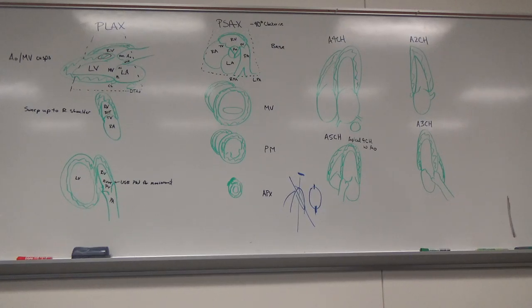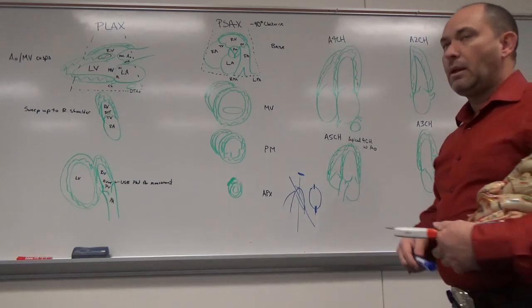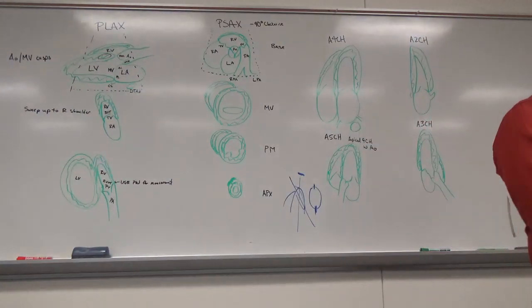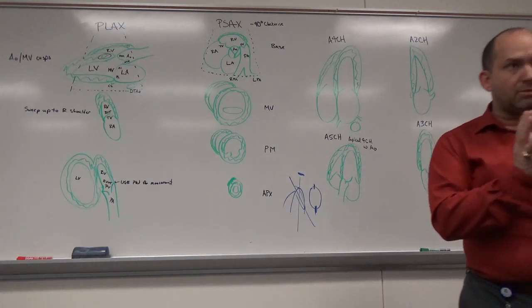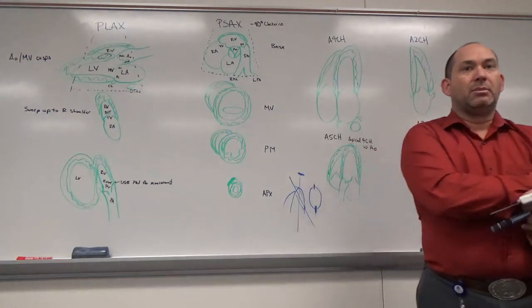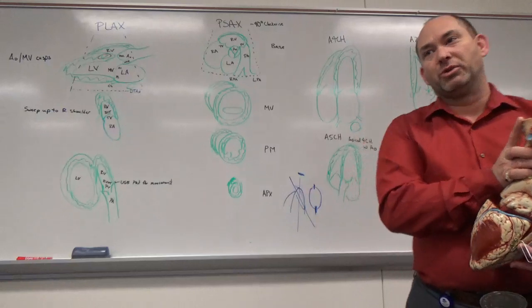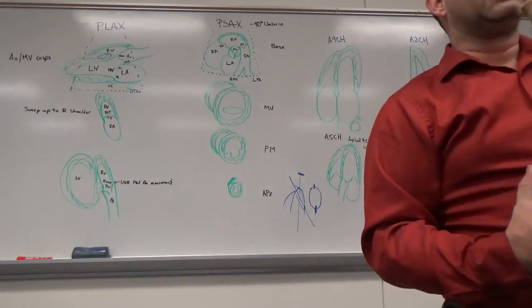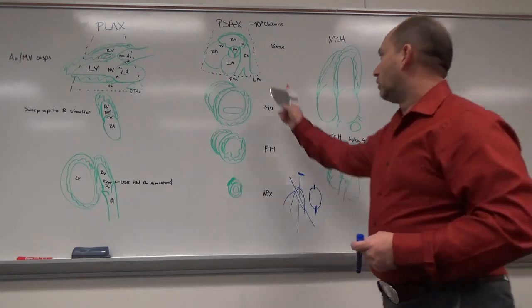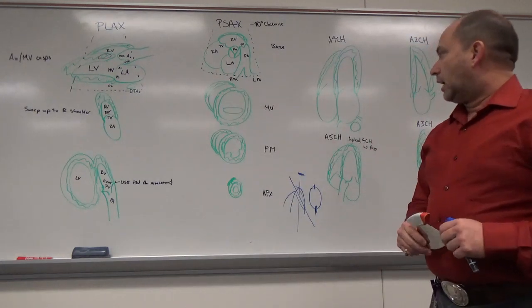It reopens it. So can they go in there and put a patch kit on that? Yes, more or less. It's called an Amplatzer device. They go through and poke through that, and there are two umbrella-type things that close over top of it and seal that up. It makes it harder for echo because now I have this hard, rigid structure in the heart giving me more shadows to deal with. But that's the reality of what we do. So that's the septal wall. Good anatomy. Next view.